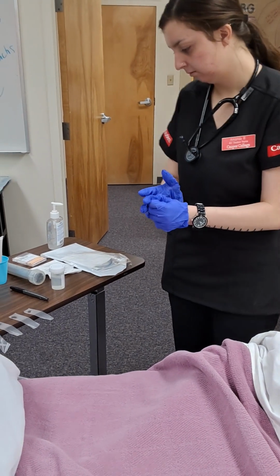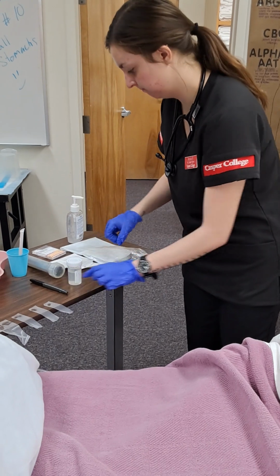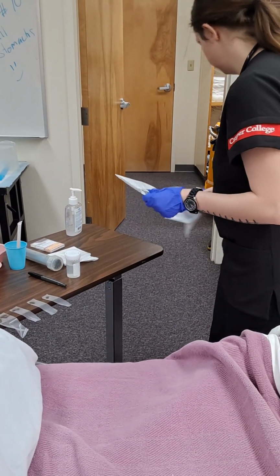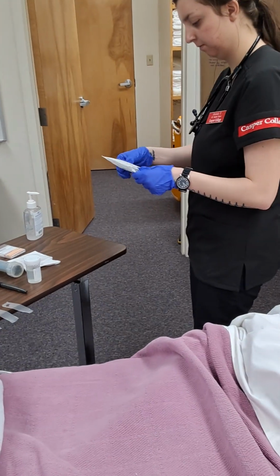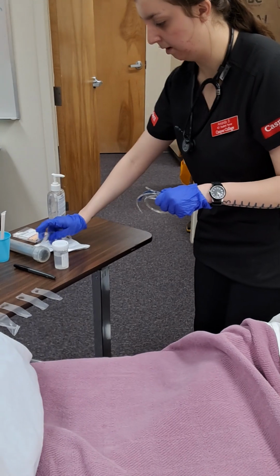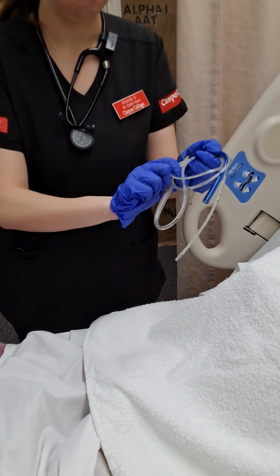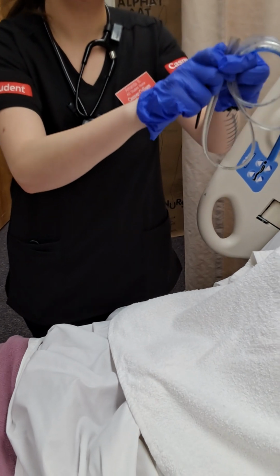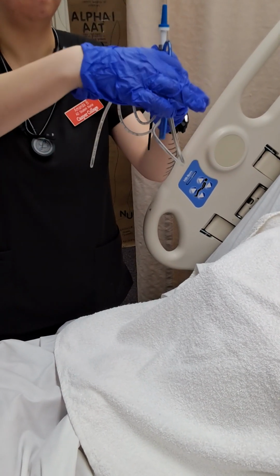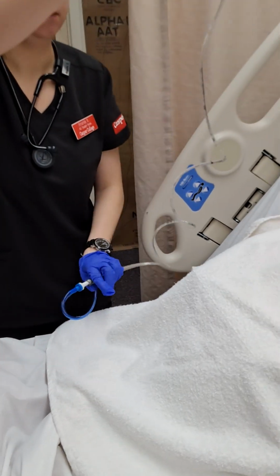Okay, I'm now going to prepare my area. I'm going to open up my NG tube. This is going in the trash. I'm going to put on my Salem sump or my anti-reflux valve. Okay, now I'm going to measure it.